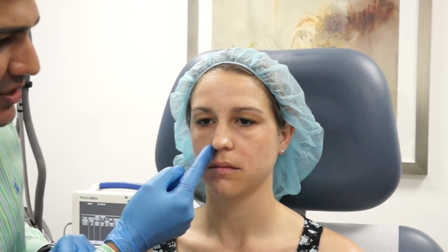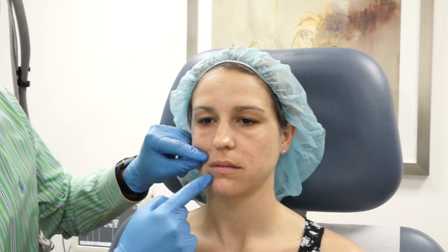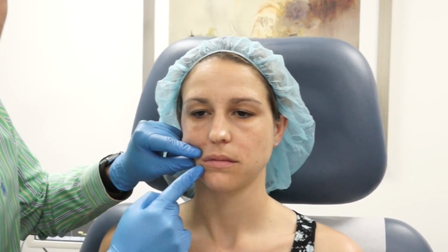This will also achieve a lift in her face, which will help with her nasolabial fold as well as marionette lines and sharpen up the corners of her mouth. You can see she's got a little bit of a nasolabial fold. She's got a superficial smile line, and you can see that the corners of her mouth are starting to slowly downturn. This can be an area of very important rejuvenation. A little bit of filler right there, support at the corner of the mouth, can really improve her appearance.